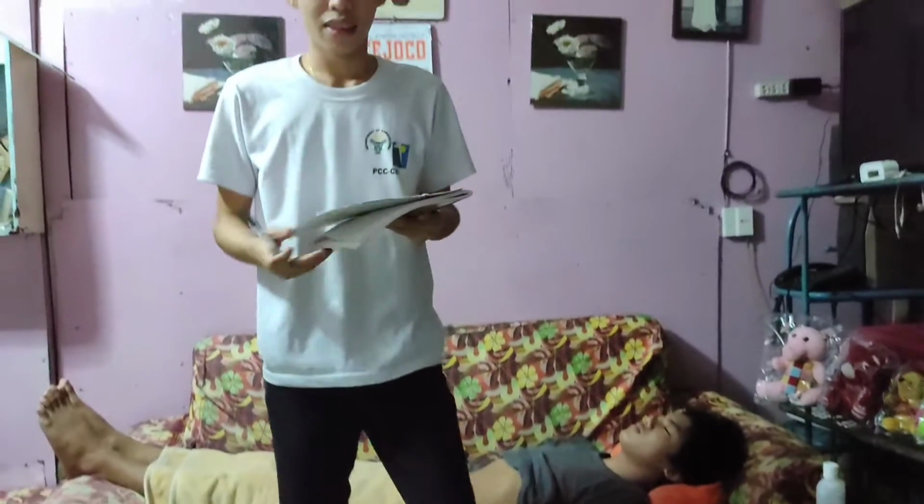Okay. Then moving on to assessing for bowel sounds. So place the diaphragm of the stethoscope on the patient's abdomen and make sure that it is warm. Also, you're going to apply light pressure or simply rest the stethoscope on the tender abdomen.